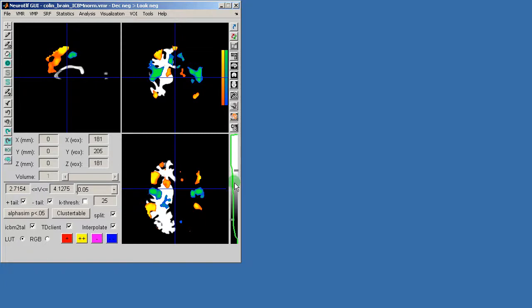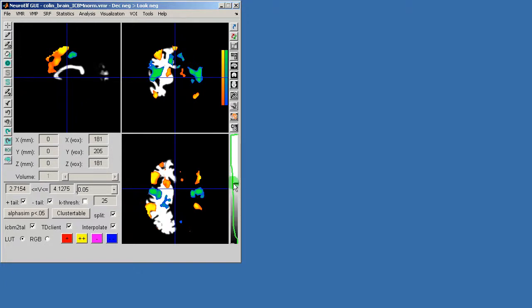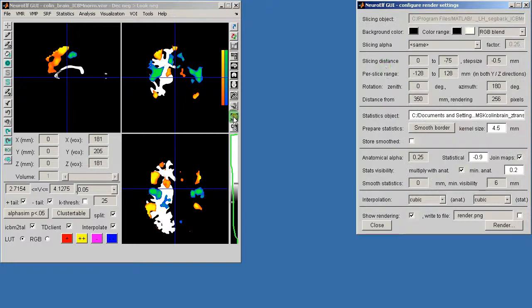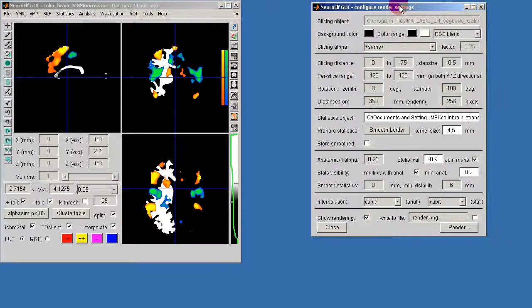Next I click the render button which opens the rendering UI. There's a lot of options in the rendering UI. Importantly you always need to define the area that you want to render and a resolution.